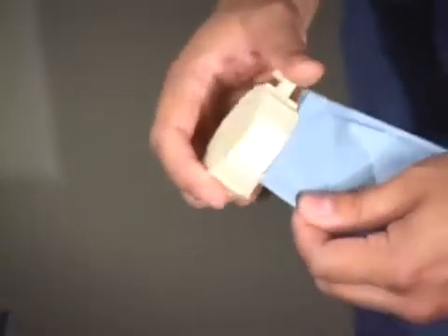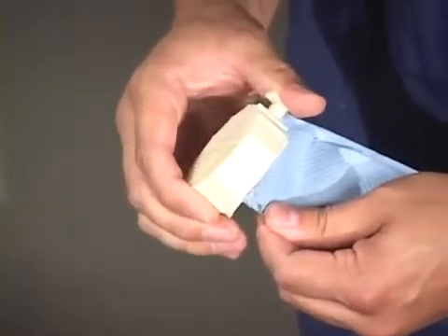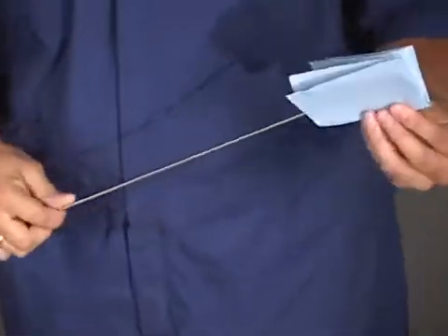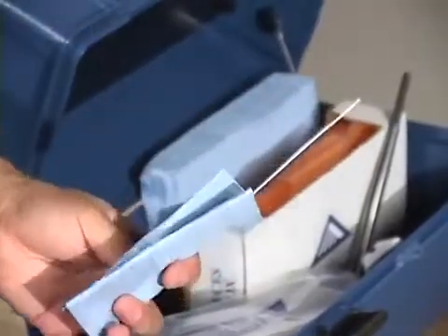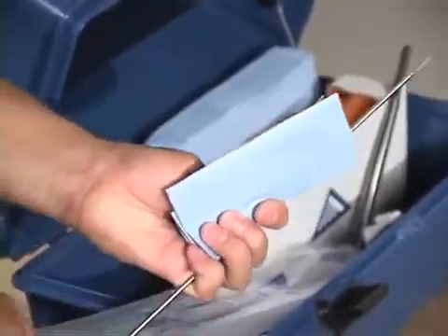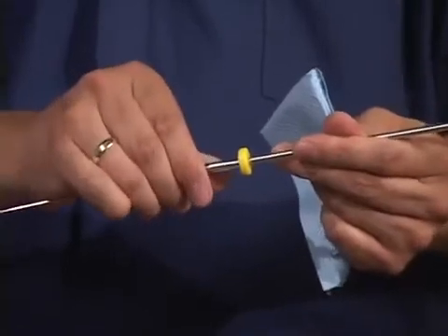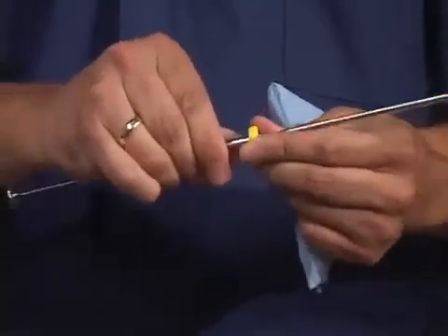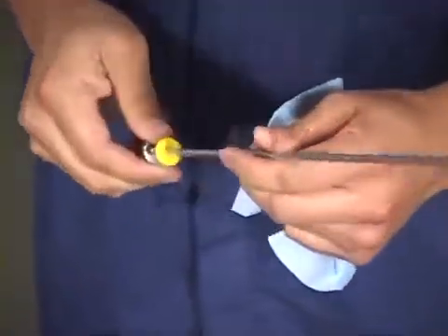Using the straw cutter or scissors, cut the semen straw at the crimped end just below the seal. Then place the straw in the gun and the sheath over the gun and straw, tightly securing it with a twisting motion to avoid leakage of sperm into the plastic sheath during the process of semen deposition.